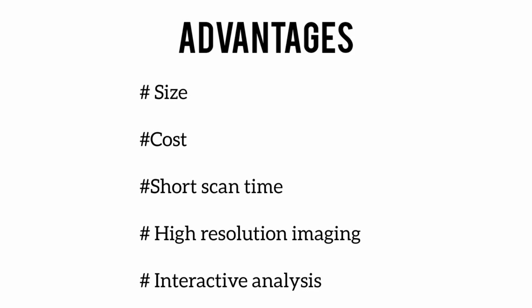So what are the advantages? Advantages is its size, that is small physical footprint. Then the cost, 1/4 to 1/5 of the cost of the conventional CT. Then it has the short scan time, most time spent explaining and setting up the patient for the scan.